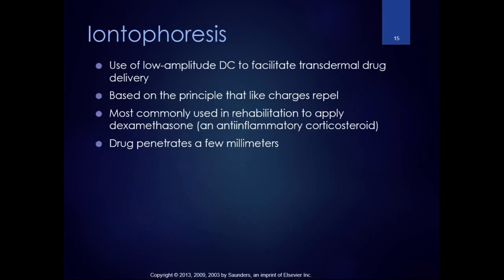So in the lab, we're going to be practicing with IFC. IFC is interferential current. It's an alternating current application. There's also pre-mod, which is also an alternating current application that uses a bipolar instead of a quadrupolar electrode setup. So say you wanted to do IFC on a really small area, like somebody's hand or foot, or a really small person that has small shoulders and there's just not enough room for 4 electrodes, that's a good chance to use pre-mod. So we'll try all those in the lab as well, as well as iontophoresis. We'll do some ionto in the lab.